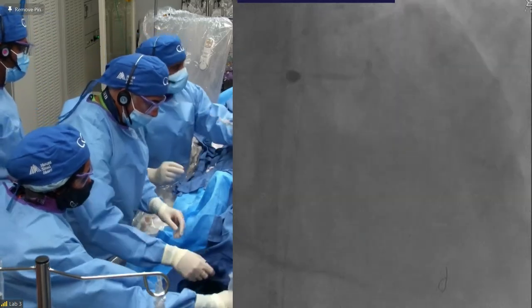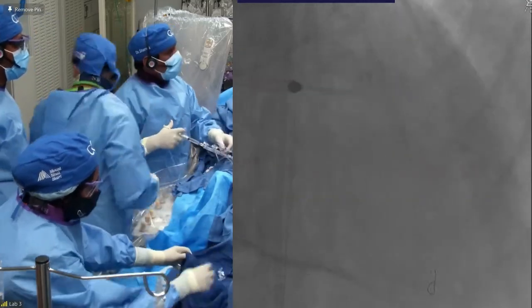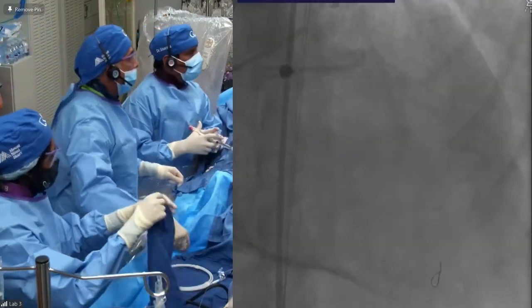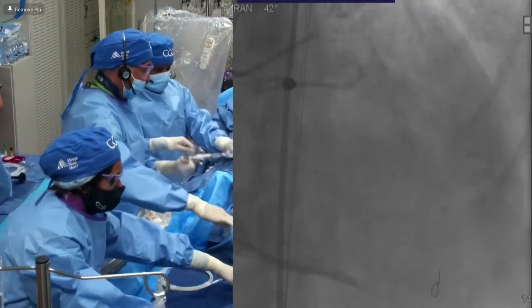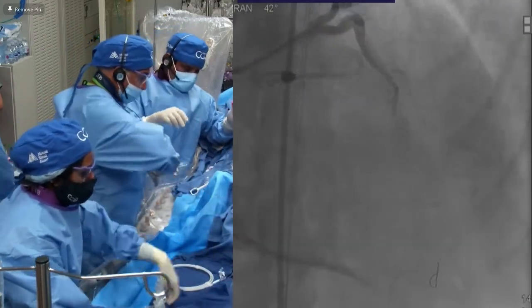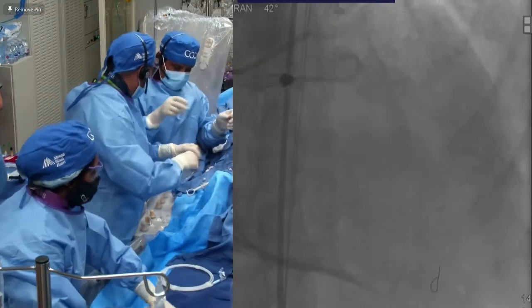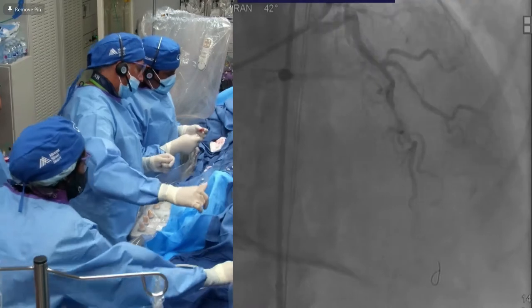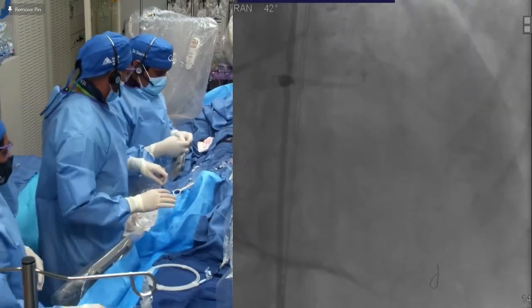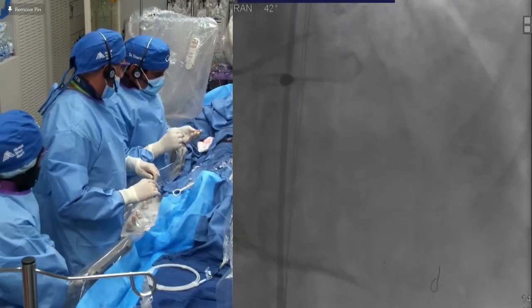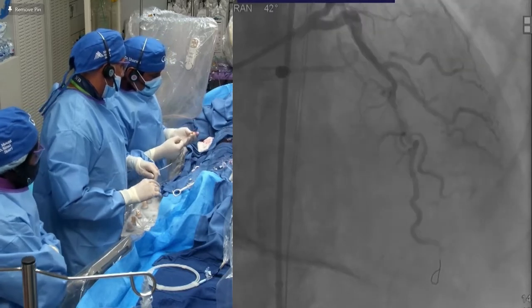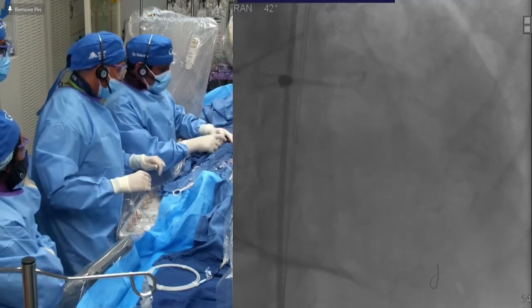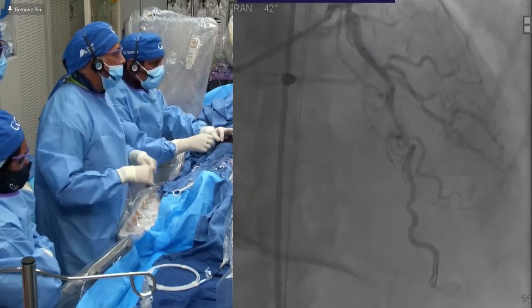I'll go to Holger Thiel - what do you think about the Impella use here? You think it's overkill? Based on evidence currently, there's no clear indication to do it with the Impella, so I'm not sure. I haven't seen the left ventricular ejection fraction in this patient. Probably this can be done without the Impella, but it will give you a better feeling in this moment if you have the Impella in place. I think he's planning to do something with the diagonal too, Dr. Sharma, and I guess that's why you chose a very small burr. I probably would have chosen a 1.75.